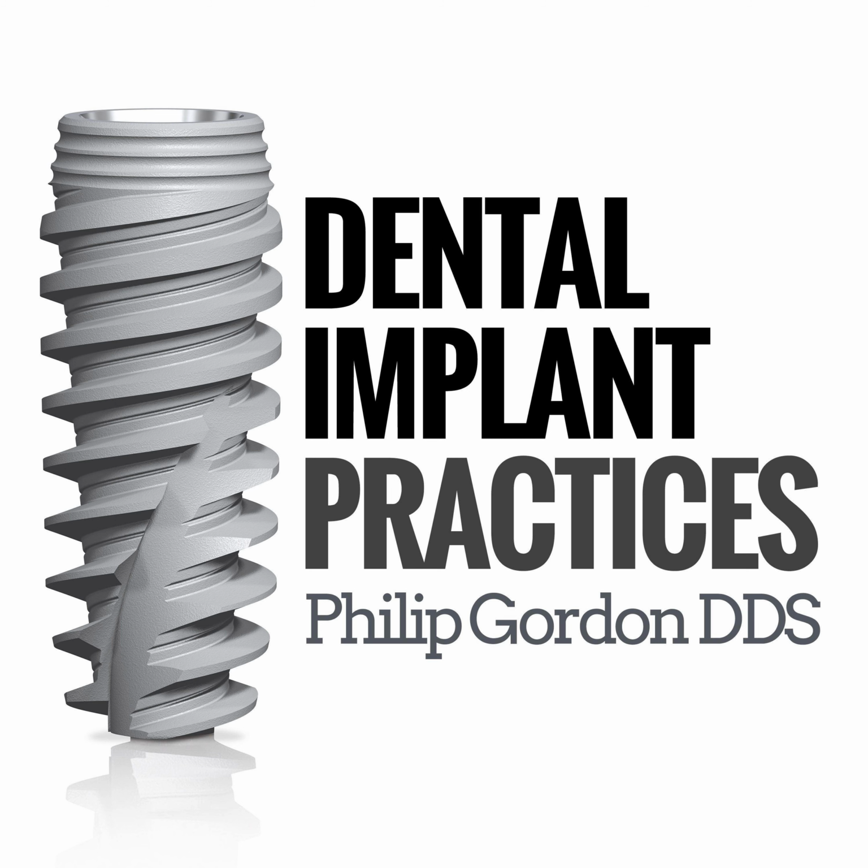So in my practice, I'm an oral surgeon. So patients come to me specifically, generally for implant placement. Either we saw them already, we took out the tooth, we grafted the site, and now they're coming back to plan their implants, or they're coming in for a new implant consult. So the patients come in, and first people to see them are my team members. And so what we'll do is we will obtain a cone beam scan. And if the patient has a fairly clean mouth, not a whole lot of crown and bridge, then they'll obtain the scan just by itself.